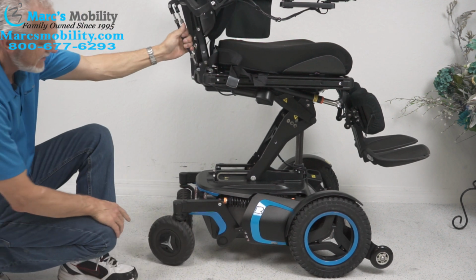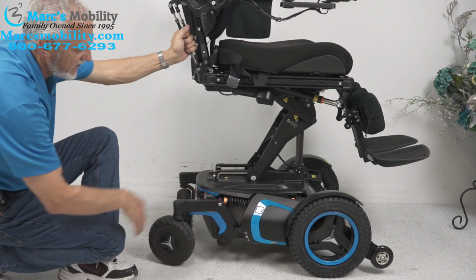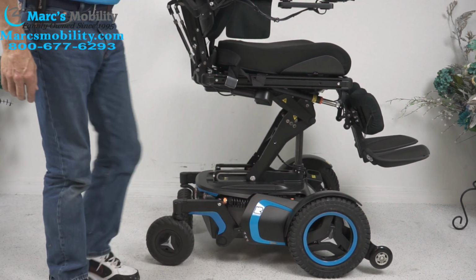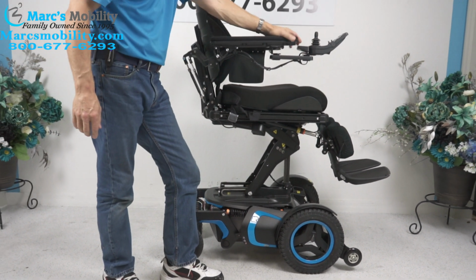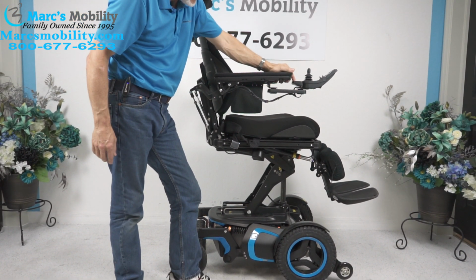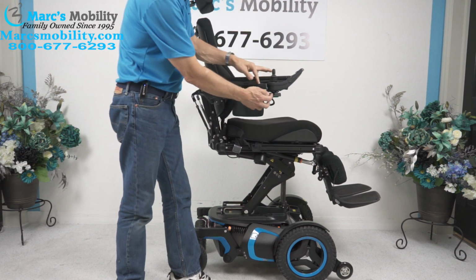Okay, so this is a custom. These tires are in addition to this chair. That's not standard. So I'm going to turn the power back on, and I'm going to bring this seat back down. So as the seat is going down, let's talk about the swing away joystick.